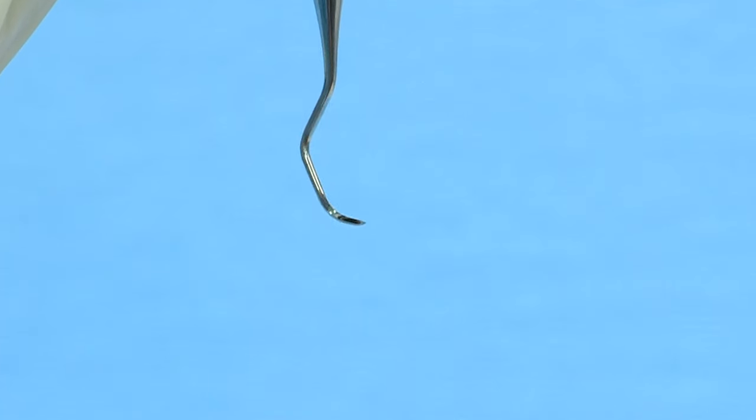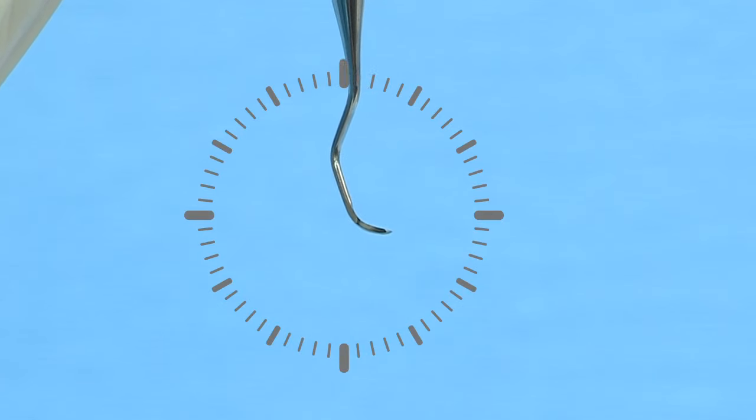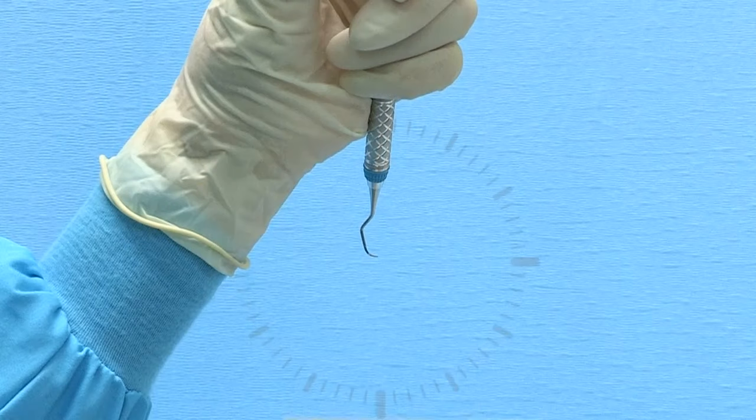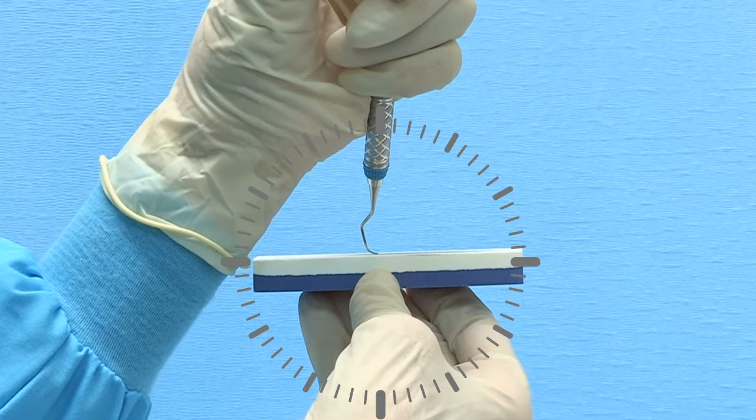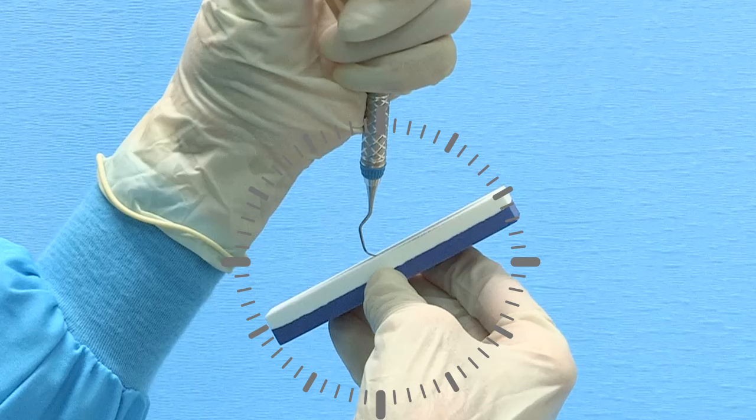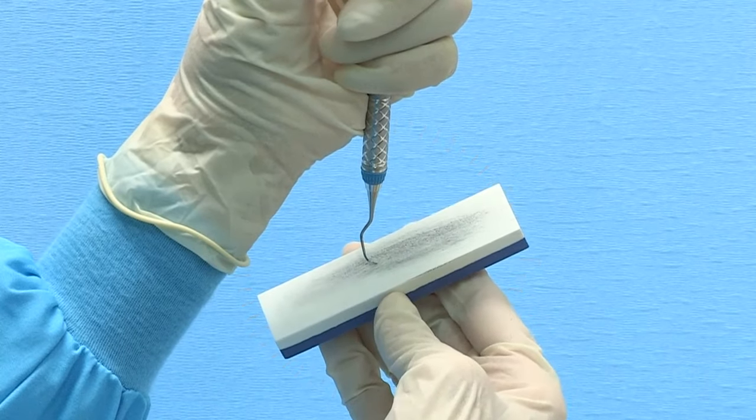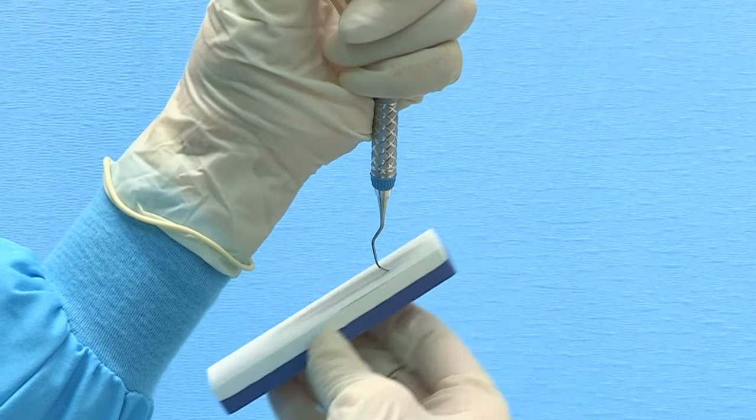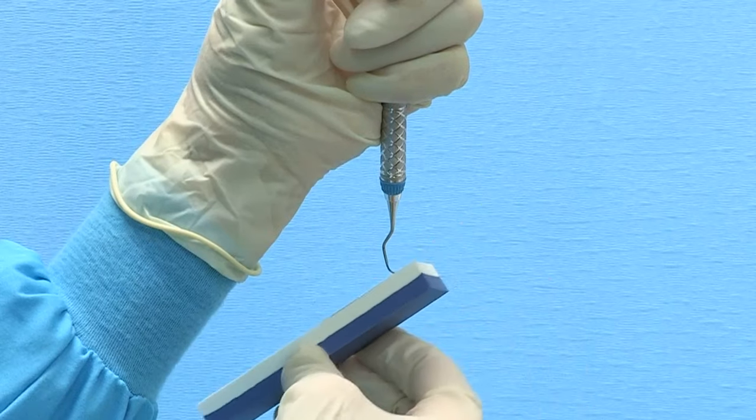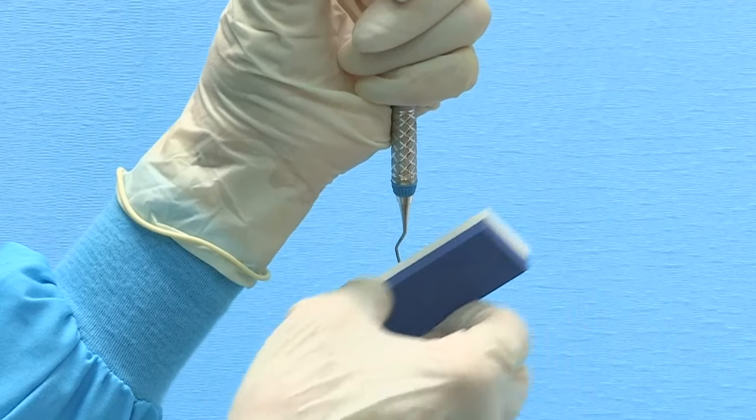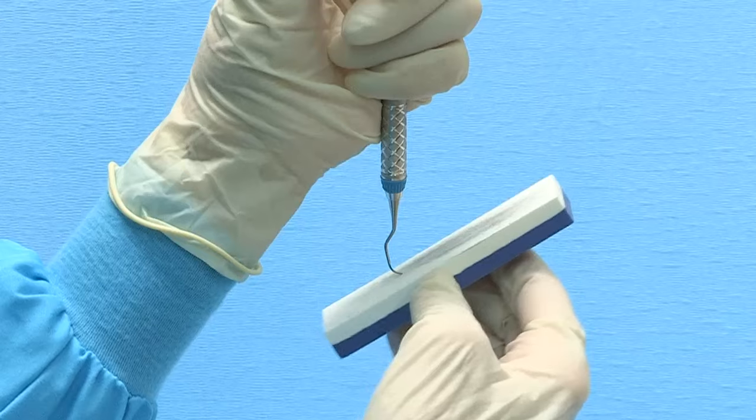To maintain the rounded shape of the curette toe, rotate the instrument handle so that the toe is pointed at 3 o'clock. Position the stone underneath the blade at 3 o'clock and tilt upward toward the 2 o'clock position. Move the stone in a consistent up and down motion, overlapping strokes, and rotating around the toe to maintain the rounded shape.